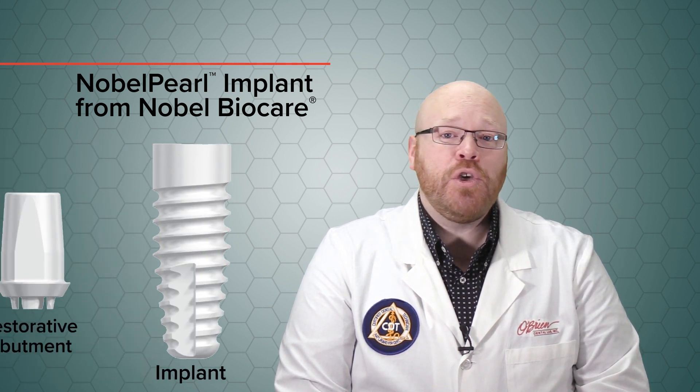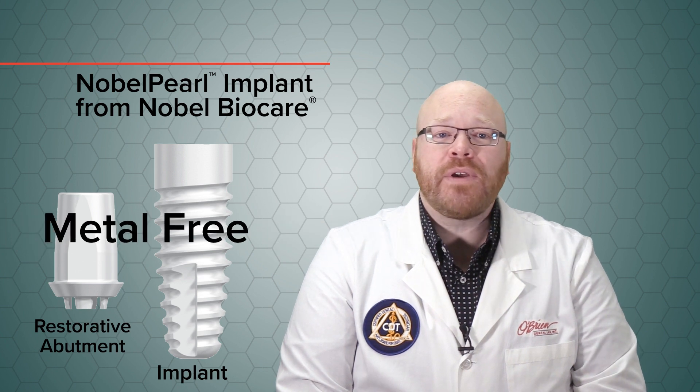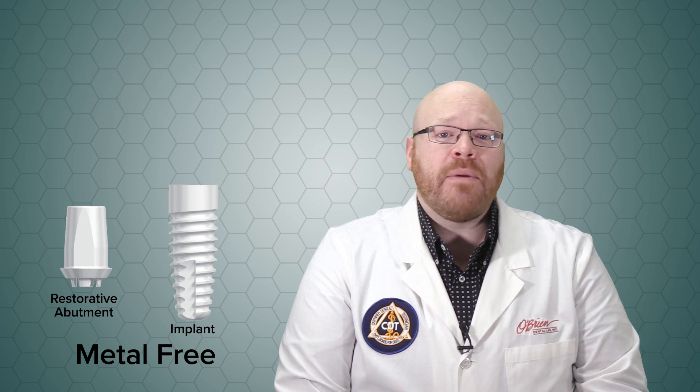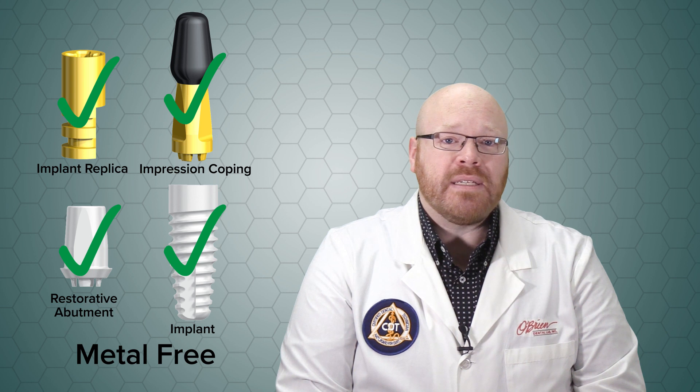The Nobel Pearl implant is a two-piece ceramic system and it's Nobel BioCare's first metal-free implant solution. And it is truly completely metal-free, from the implant itself to the restorative abutment and even the impression copings and implant replicas.